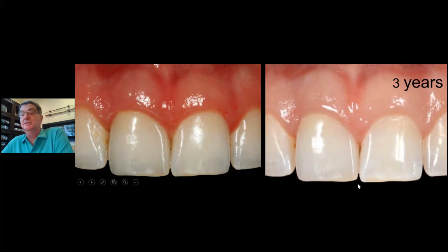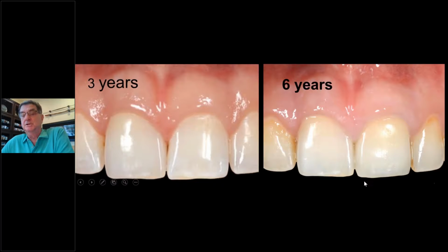We didn't even see it. In fact, we didn't see it until we put it on the screen to give this lecture. So you notice that it's just dropped a little, but even at 6 years, it stayed the same. We never adjusted. So that's a separate topic for discussion, but definitely happens with attrition, tooth erupts, and that's part of what we see with changes over time.